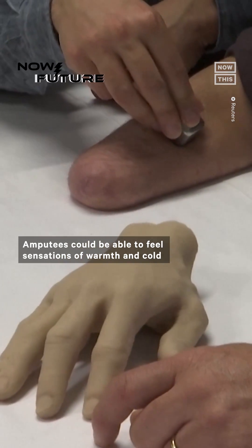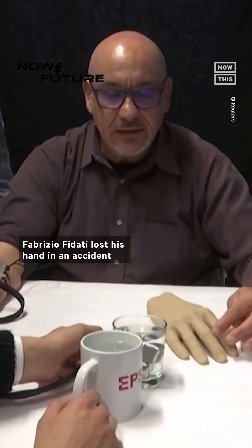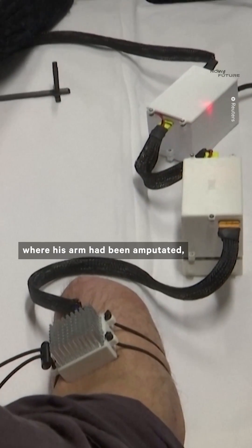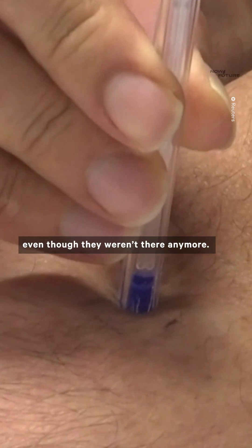Amputees could be able to feel sensations of warmth and cold in their missing limbs thanks to this incredible new technology. Fabrizio Fidati lost his hand in an accident 25 years ago. But when researchers placed thermal electrodes near where his arm had been amputated, he reported being able to feel temperature in his hands and fingers even though they weren't there anymore.